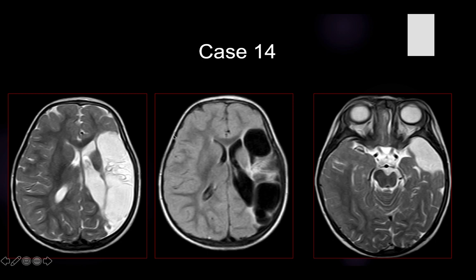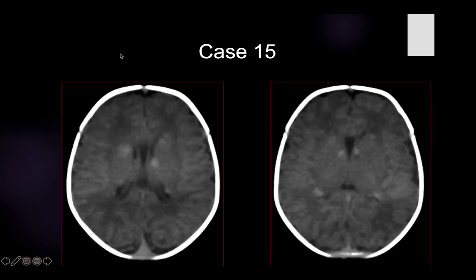Any item that is not mentioned in the diagnosis will lower the degrees, because every item of this diagnosis has a mark. So you have to say that it is a chronic infarction, it is a left MCA territory, and you must say that it is associated with ipsilateral Wallerian degeneration, brainstem Wallerian degeneration.